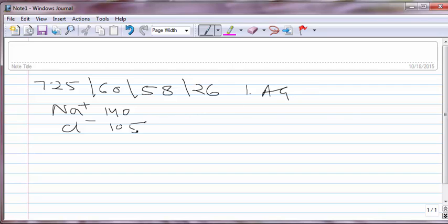Anion gap would be 140 minus 131, which is 9. So delta gap would be less than 0. So there is no anion gap metabolic acidosis. Let's see what is happening now.